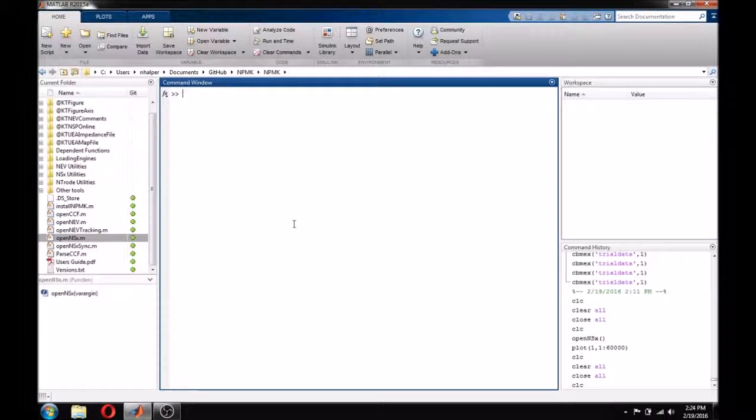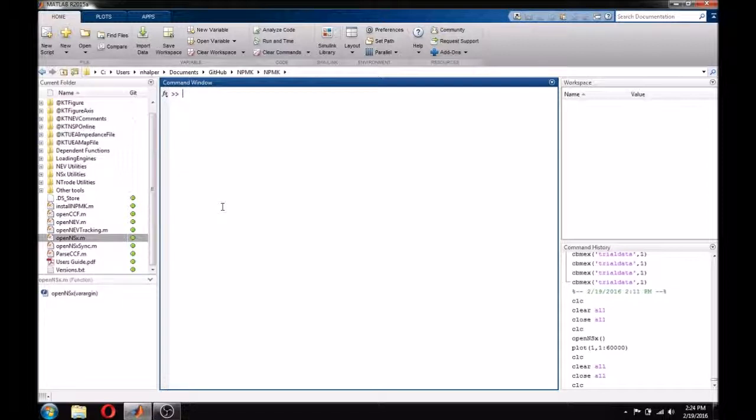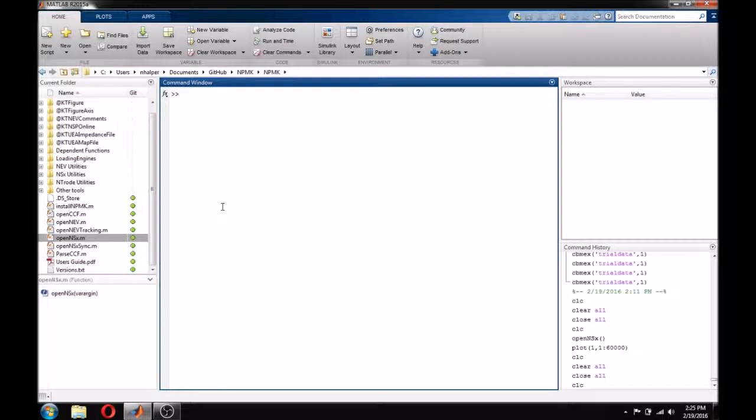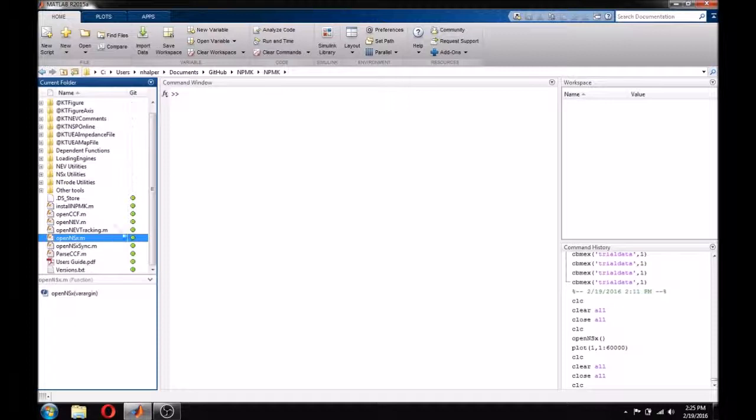The NPMK is primarily used for loading BlackRock data into MATLAB, but it has many additional functions for manipulating BlackRock data and data files. This tutorial will cover the basic use of the two most common functions in the NPMK, OpenNEV and OpenNSX.